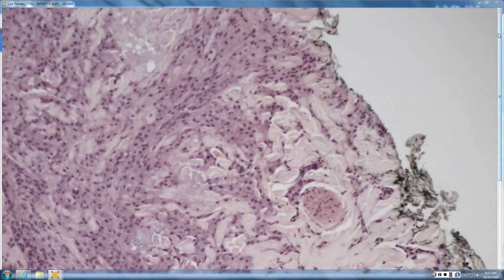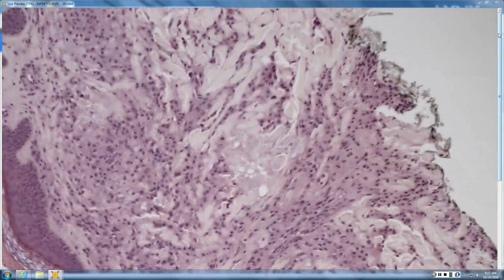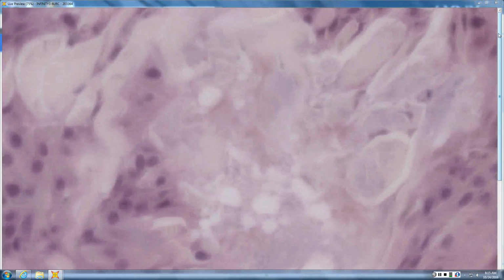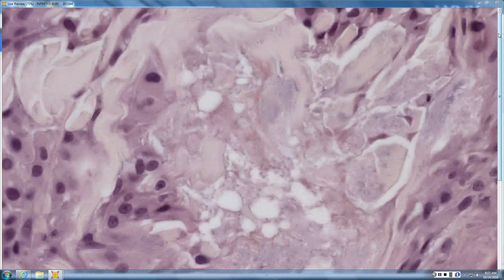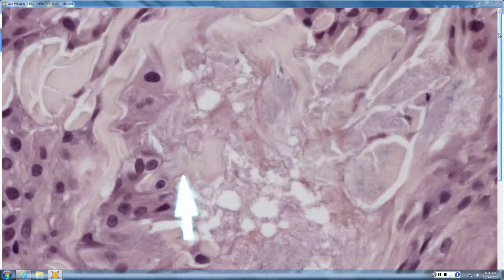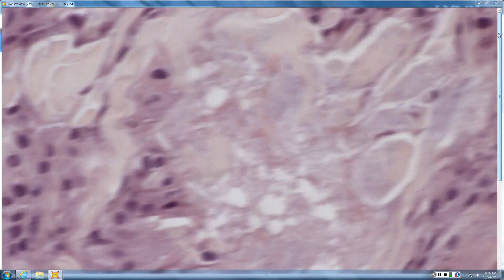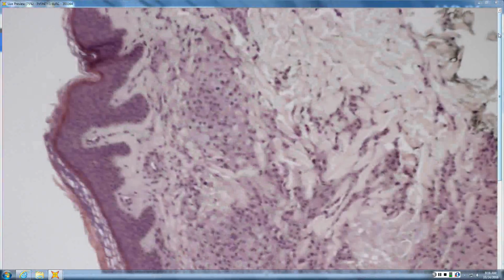Histiocytes in the dermis, and what's their pattern? Kind of between interstitial and palisaded. So normally you would think of GA, but when you look at the stuff in the middle, instead of being granular like mucin, it's a little feathery. Feathery, so this is gout? Like gout, or what else? What looks kind of similar to gout? Pseudogout.